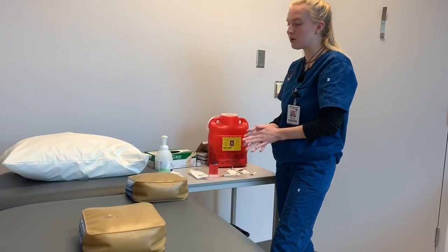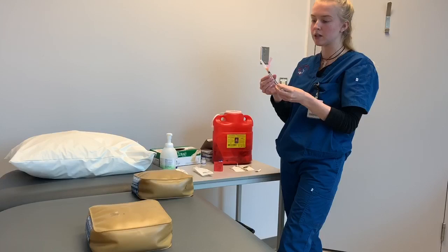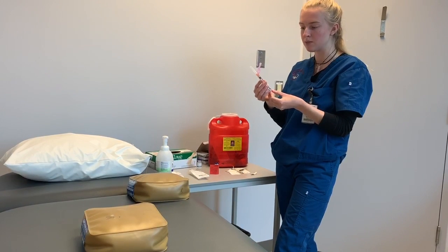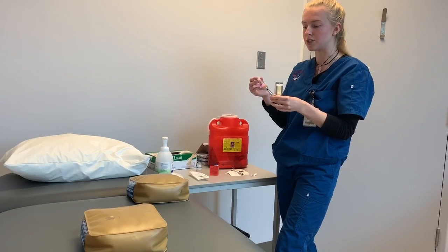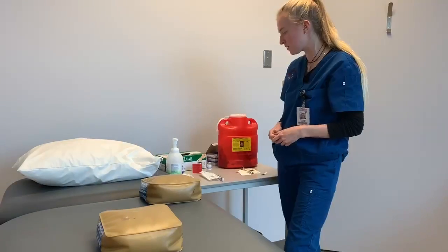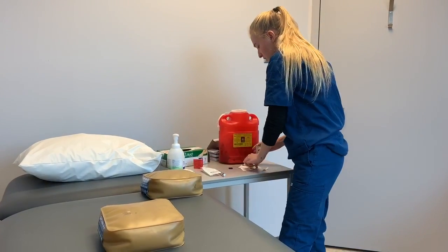Okay, so the needle that we're going to be using for the intramuscular injection is a 1 milliliter syringe because we're administering 0.5 milliliters of Haldol, and then we're using a 22 gauge needle because it's bigger for the intramuscular injection. Okay. So I'm going to open up my vial of Haldol and clean it off.